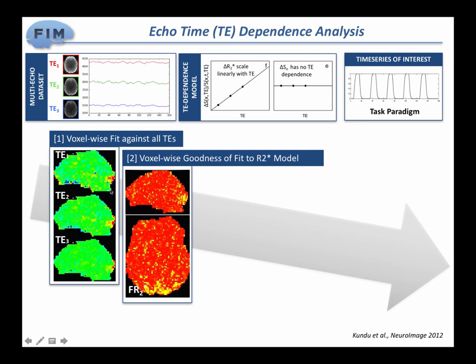Then once we do that, for each voxel, we have the 3 values of how big that signal appears. We can try to fit this model, and we can get an F statistic that tells me how good this linear model fits the data in a given location. This starts to look like maybe this was a visual block design experiment, and it seems that here in the back of the brain, this fits the data pretty well.